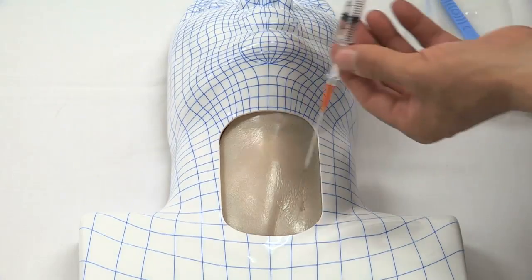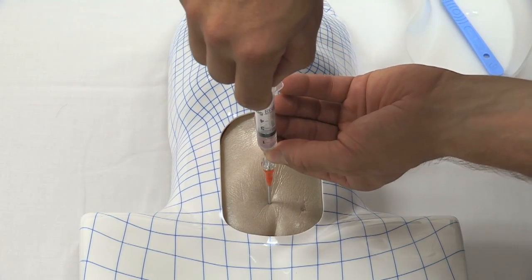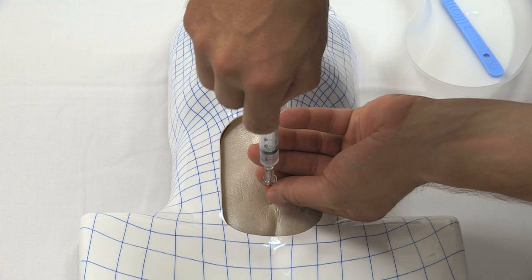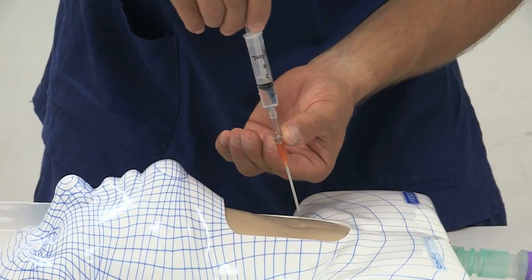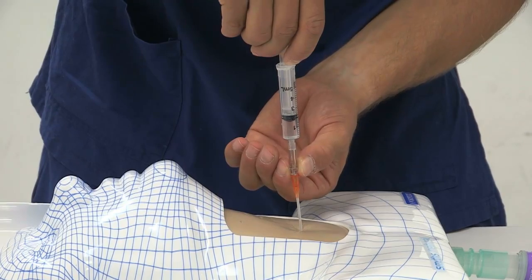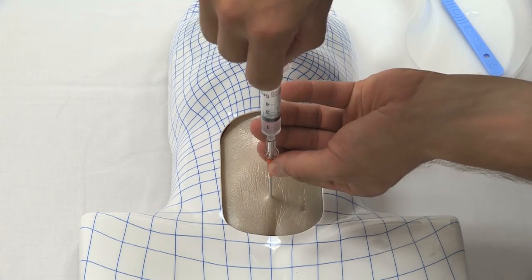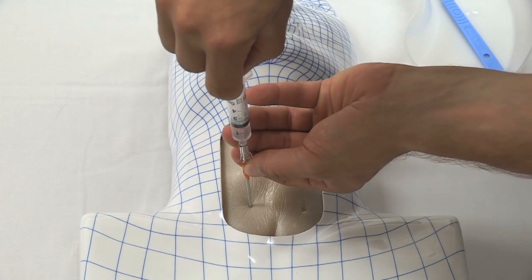The syringe is held by the dominant hand, while the non-dominant hand stabilizes and fixates the trocar. In this situation, a vertical approach is required to maximize the chance of reaching the airway, which may be deep under soft tissue. A systematic approach is required, starting at the midline and consisting of no more than three attempts or a maximum time of one minute.